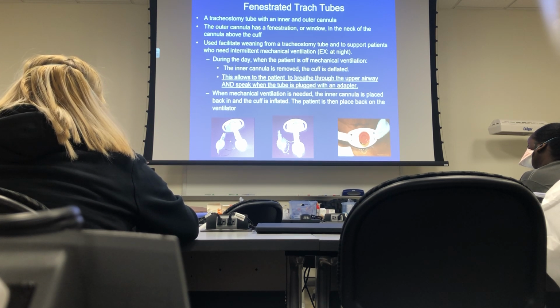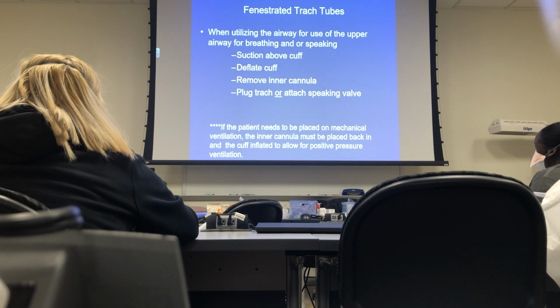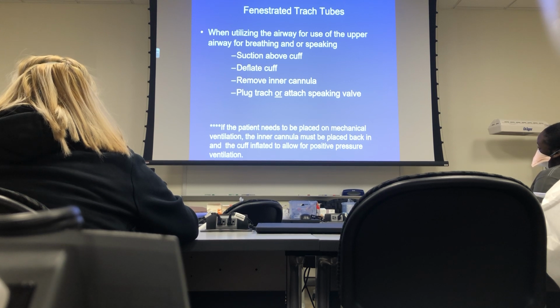It just says if the patient's off the ventilator during the day and they have a fenestrated trach tube in, plug it, get them used to using the upper airway, let them talk, okay? If they don't have a fenestrated trach tube in, it's a regular trach, we drop the cuff during the day and let them use their upper and lower airway, okay? Okay, so here's when you're using one of these, again: suction above the cuff, deflate the cuff, remove the inner cannula, plug the trach. Those are the steps, okay?